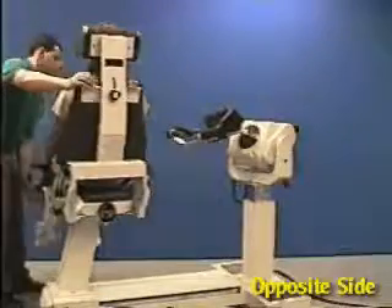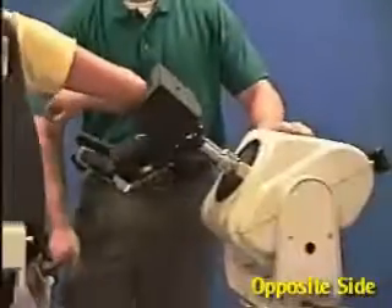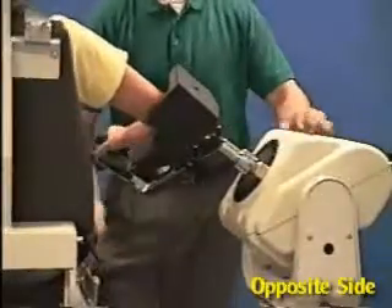Move the patient into position, verify the axis of rotation, and check the range of motion.